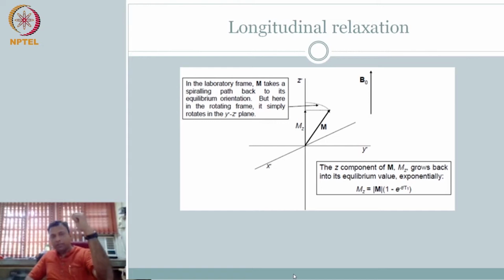What we covered so far is if I apply pi by 2 pulse, I get the maximum signal, and all our illustrations that we have shown, we have pushed it to the floor, allowed it to dephase, record the signal, and this is a T2, T2 star, T2. No, there are two relaxation times involved.